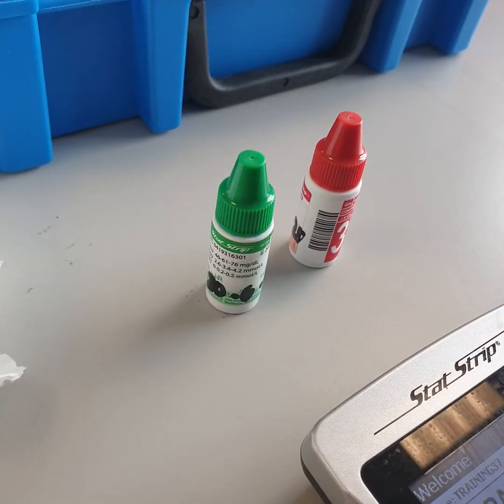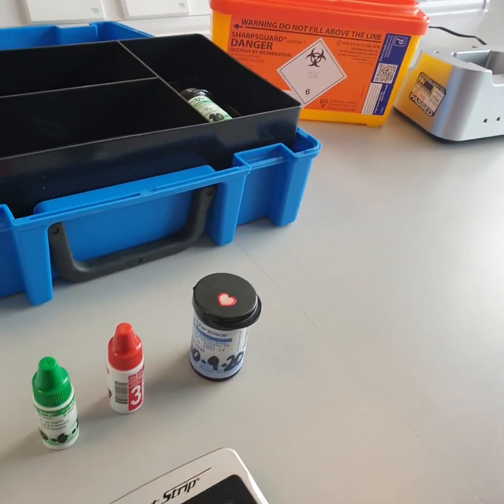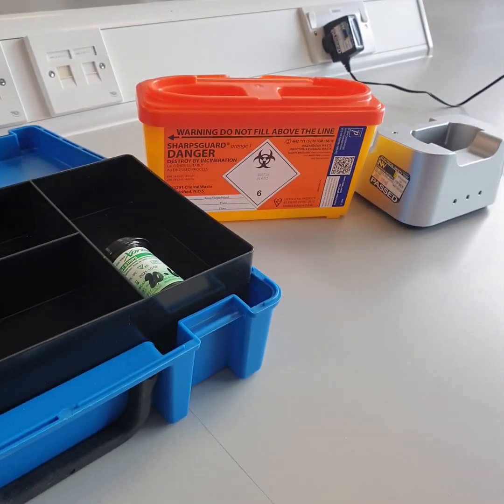You also need blue test strips that are in date. They are stable for six months from date of opening and the expiry date should be written on the bottle. You also need sharps bin and disinfectant wipes.